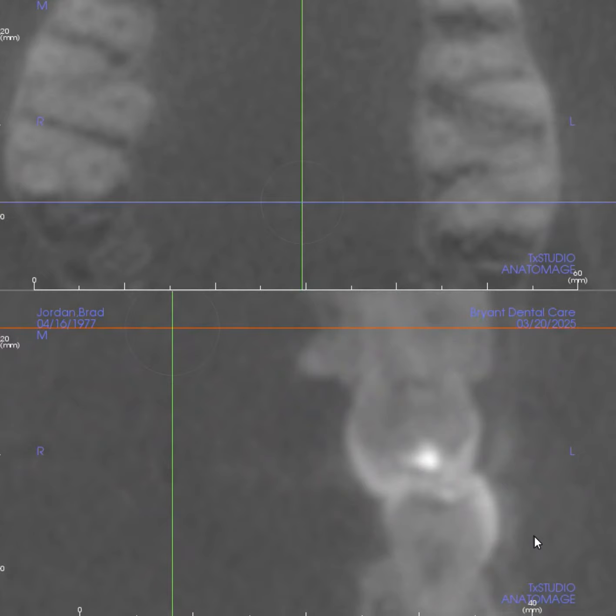And the only way for us to find those is if the patient can grind backwards, which is hard to get them to do, or we help them do it. And a leaf gauge is the tool that we use for that. In that case, essentially you're using that red articulating paper with the leaf gauge to try to encourage them to go backwards. And it's a little more complicated than that. Feel free to watch the video on the leaf gauge adjustment on these kinds of things if you have any questions. And feel free to reach out. I'd be super curious on what transpires here, but I think it's safe to say this is not a crack.